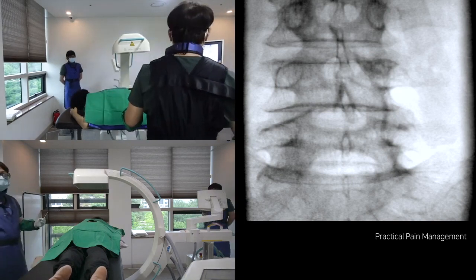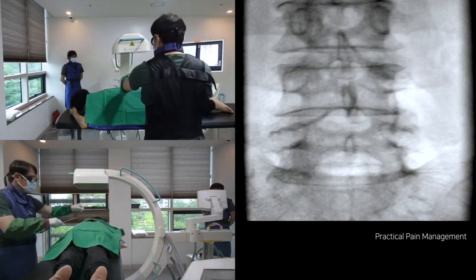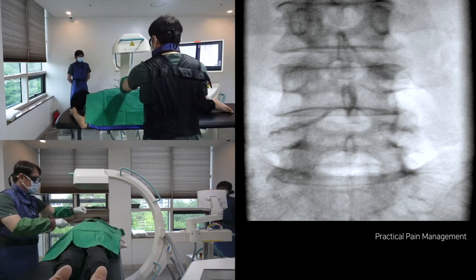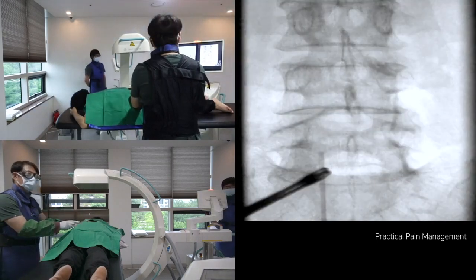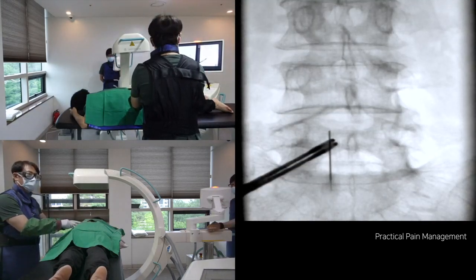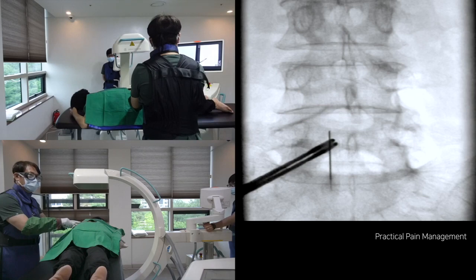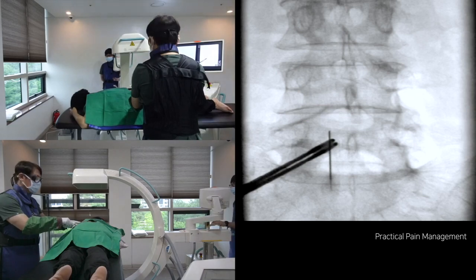Let me begin. It is an AP view. I will make a left parisagittal interlaminar epidural approach at the L4-5 level. The C-arm image shows a well-defined border of the lamina's inner aspect.